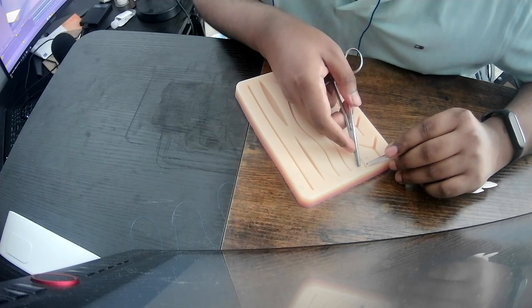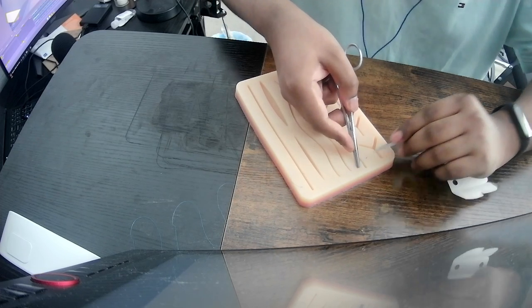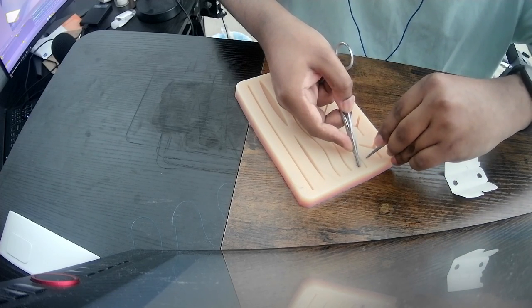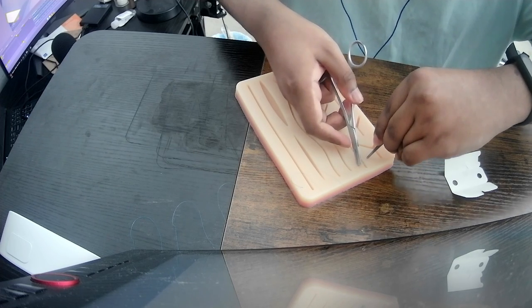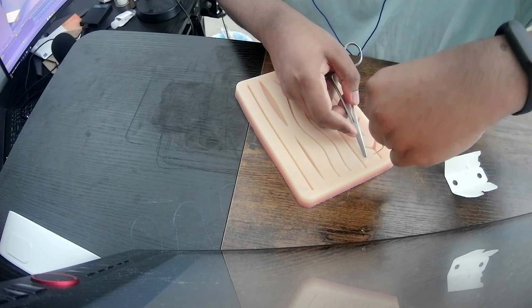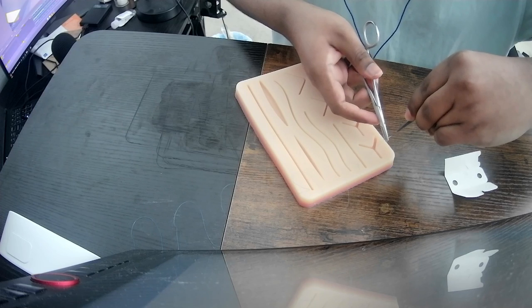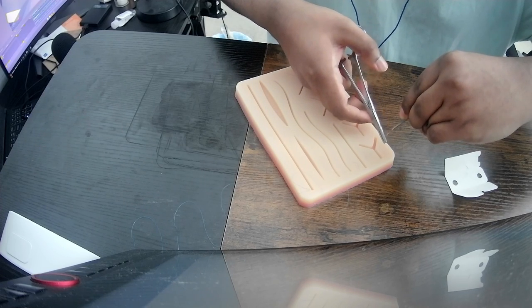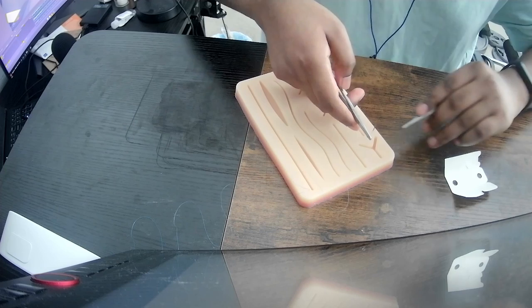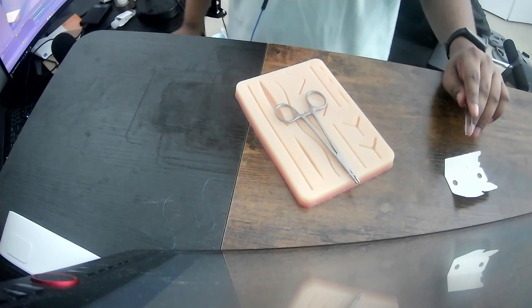I think I dug too deep, or I exited too late, or something. But let me still follow through. I want to try. This is fun. So excited. Okay, let me reload the needle. Careful not to let go. Okay, so the suture is going through. Okay, that was my first time.